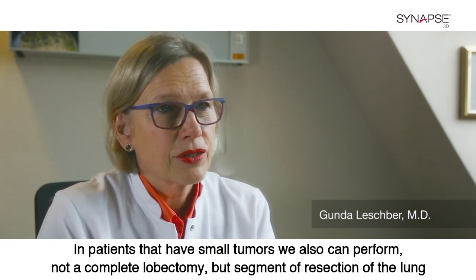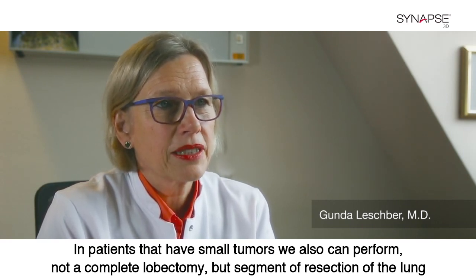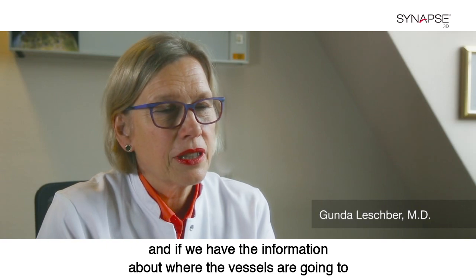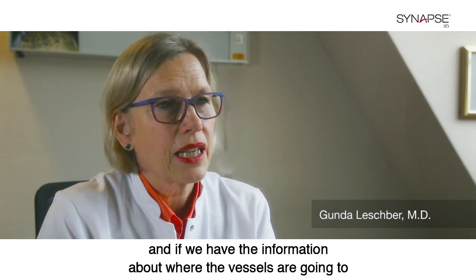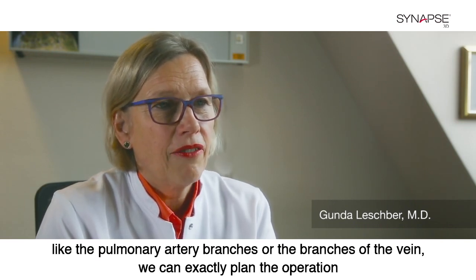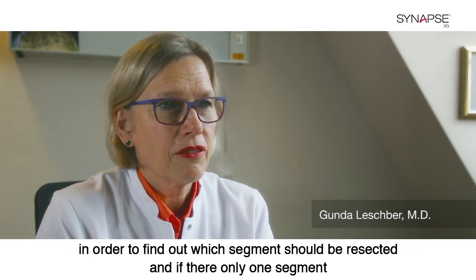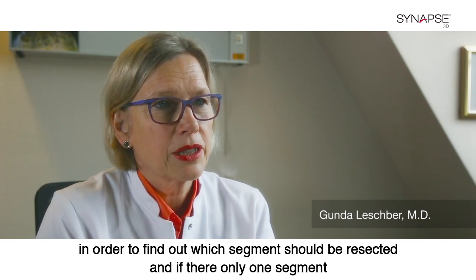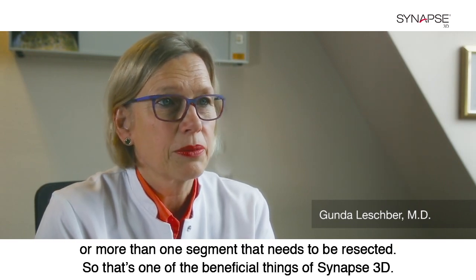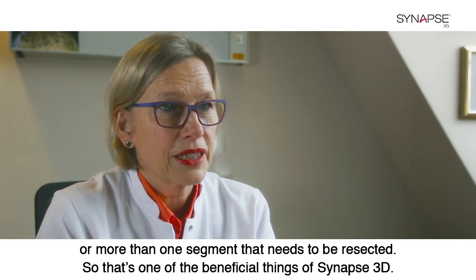In patients that have small tumors, we also can perform not a complete lobectomy, but segmental resection of the lung. And if we have the information about where the vessels are going to, like the pulmonary artery branches or the branches of the vein, we can exactly plan the operation in order to find out which segment should be resected, and if there's only one segment or more than one segment that needs to be resected. So that's one of the beneficial things of Synapse 3D.